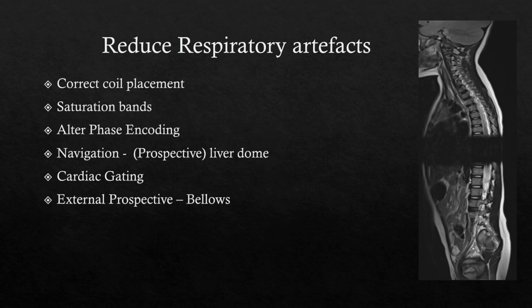Moving on, you have saturation bands. There's an image here of a saturation band placed in slightly the wrong position. That's what you don't want. So what you would do is place your saturation bands over the areas of large motion.